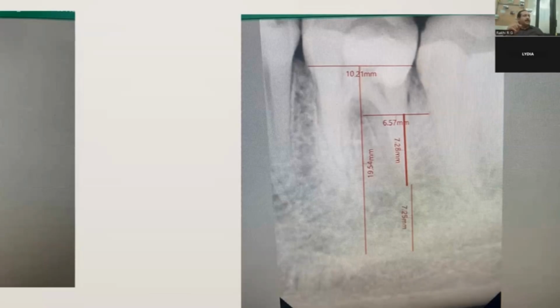You cannot have two separate crowns, because for that we need at least 2 millimeters between this tooth and the nearby implant, which you're having less here. So since you are planning to connect it, that much of a 0.5 millimeter is spared here. So your final implant will look closer to the mesial root of this particular tooth, long enough to have primary stability, sparing bone between the implant and the distal 7, flushing with the interradicular bone area.